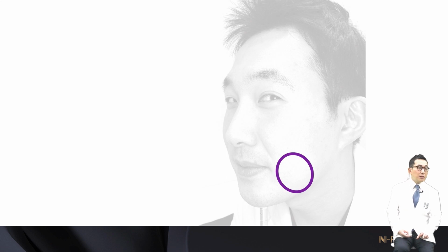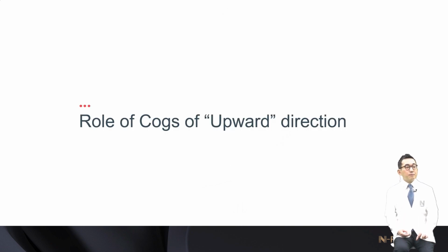Dividing the face into upper and lower portions, usually the lower portion of the cheeks is sagging and mobile tissue. So we lift up this area to the relatively hard and immobile temporal areas and fix. Dividing the face into anterior and posterior portions, the anterior area is relatively mobile and the posterior is immobile. So we can pull the saggy jaw toward the ear and fix.